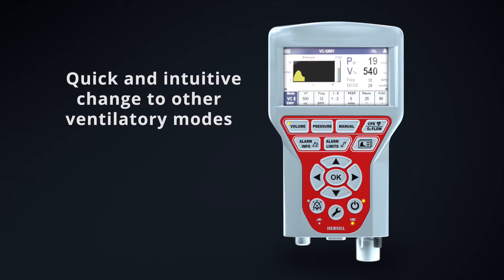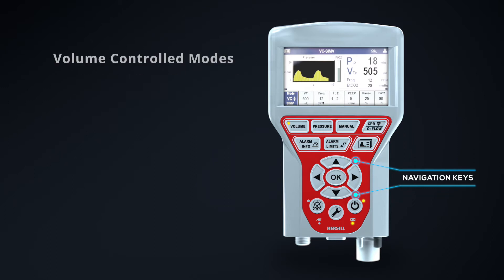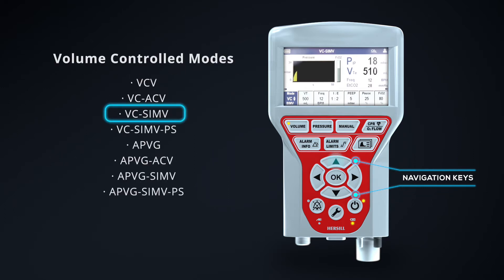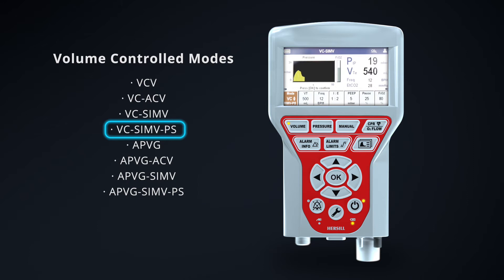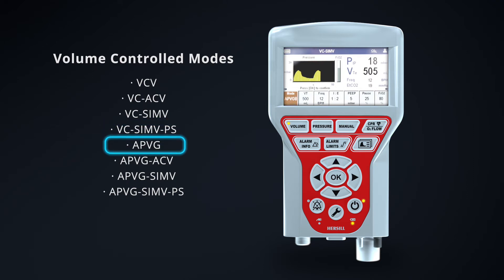The selection of other ventilation modes is quick and intuitive. To switch to other volume controlled modes, press the navigation keys. Switching to the desired ventilatory mode, in this case adaptive pressure volume guaranteed, will not occur until you confirm it by pressing OK.